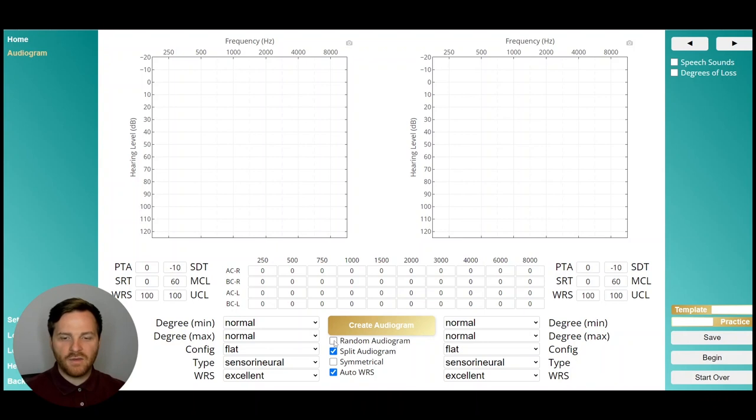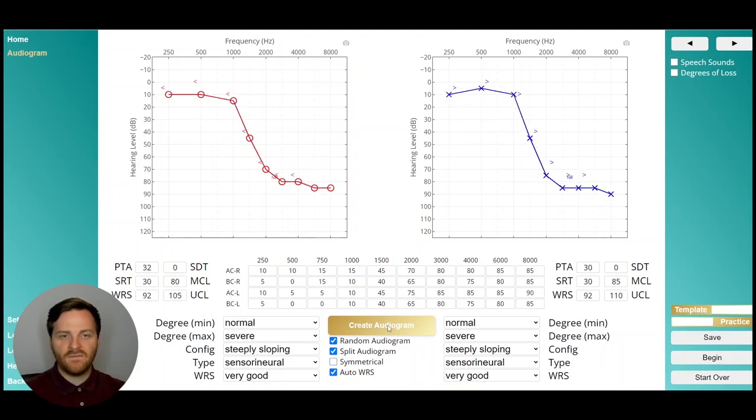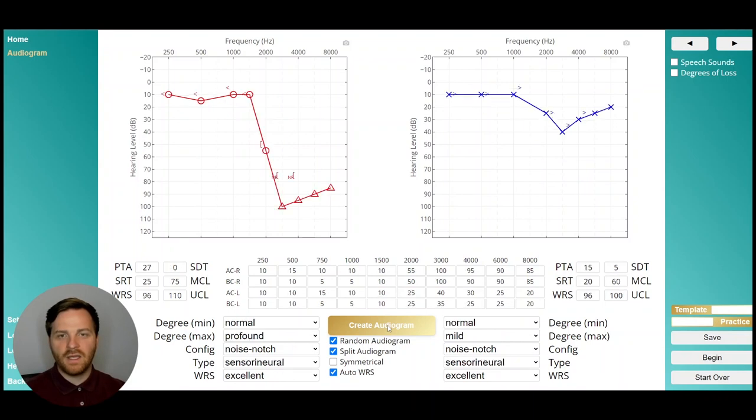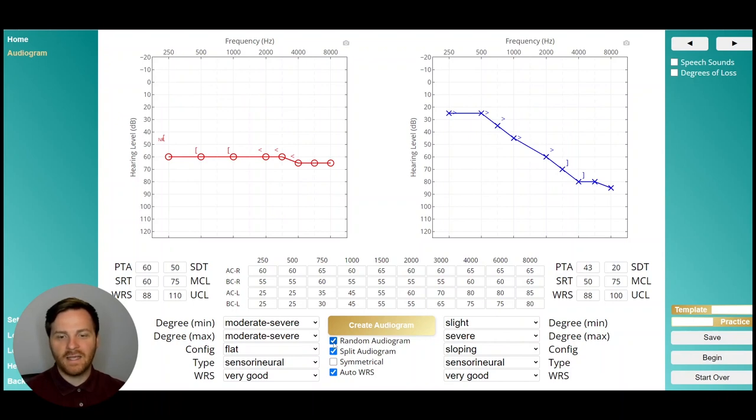Underneath create audiogram you have random audiogram. If you check random audiogram and click create, it will adjust the degree type and configuration to randomly create a new audiogram for you. If you wanted just a place to start, you can click through until you find an audiogram that looks interesting or tests a particular skill that you like.